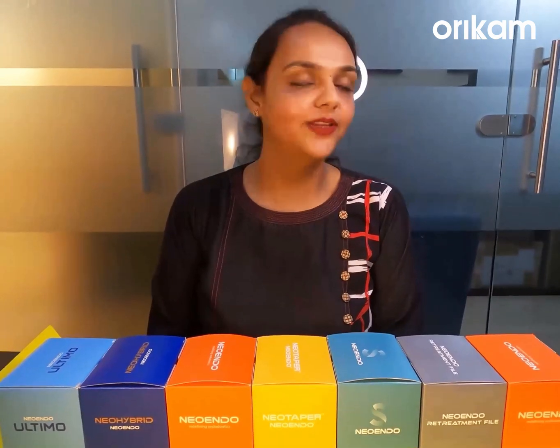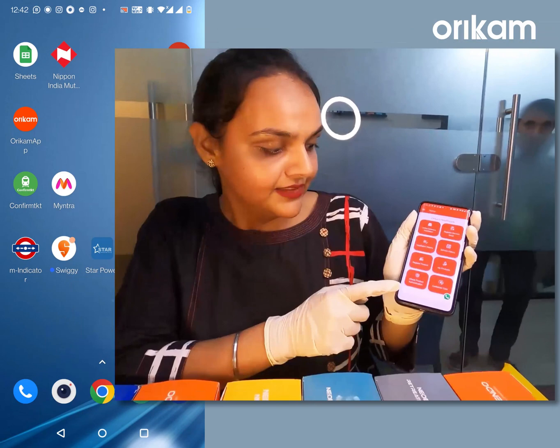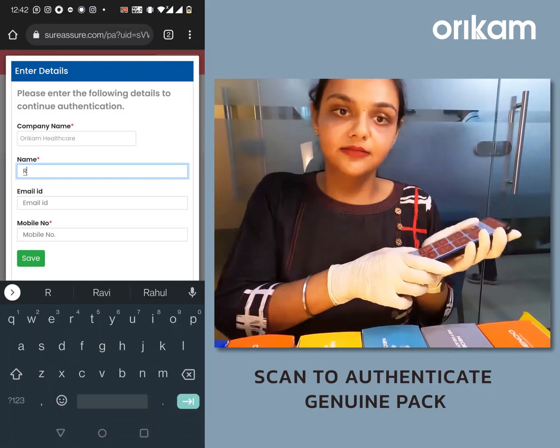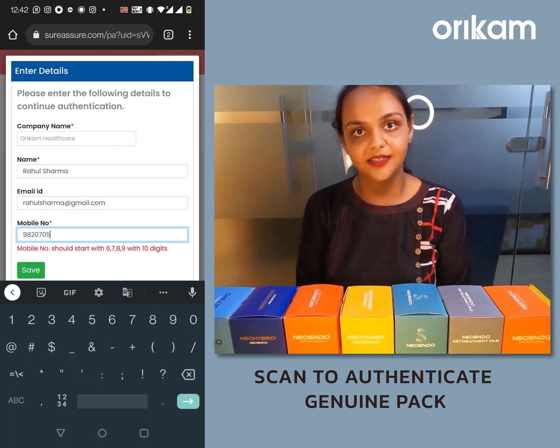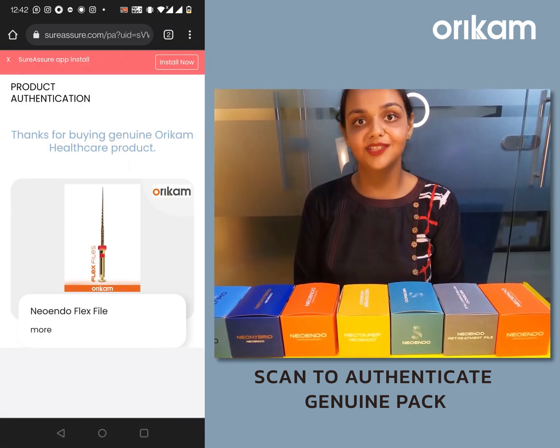The price of the file is same irrespective of the size, taper, length, assorted or refill packs. If you want to verify the authenticity of the product, you can visit the Oricam app and click on the Check Product Authentication option. Scan the QR code and it will direct you to the sureassure.com website if it is an original product. In case you see any other statement, it might indicate that the product is not original.